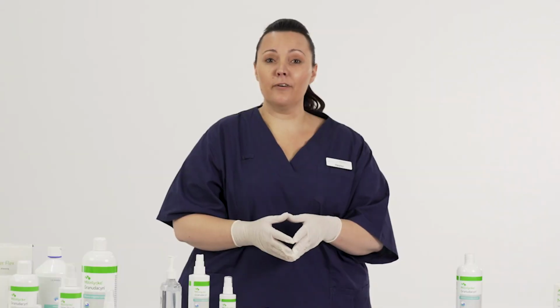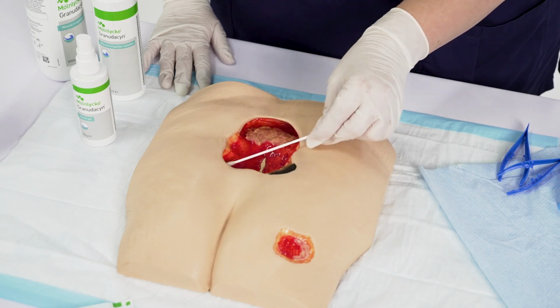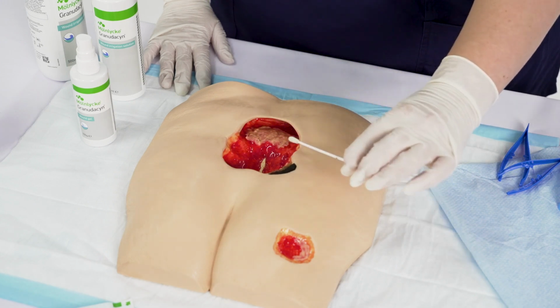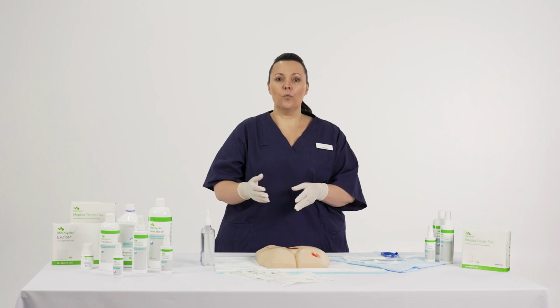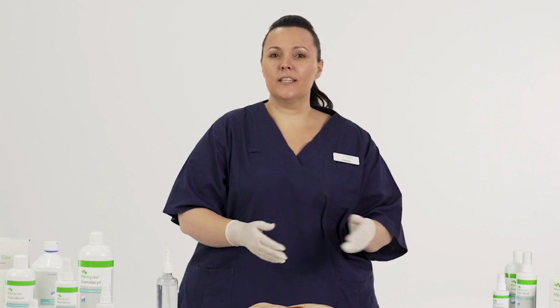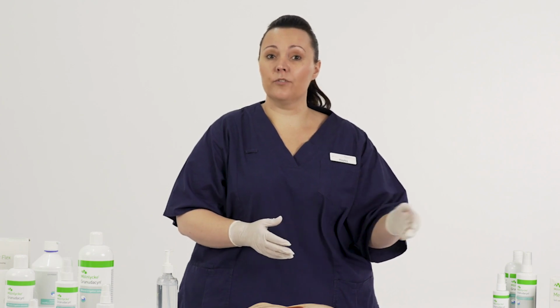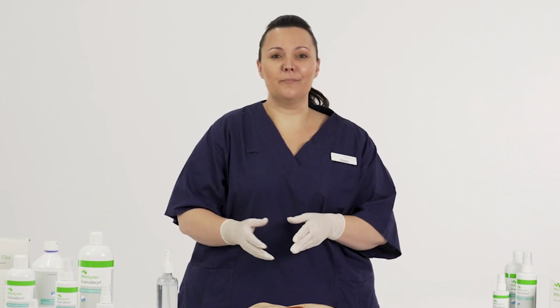Following wound bed preparation and cleaning, the wound bed needs to be reassessed for the tissue type. If the wound bed is deep, such as a cavity or tunnelling, or if there's any moderate to high amount of exudate, the wound bed will need to be packed with a gelling fibre dressing. Today I'm using Extra Fibre, or if the wound is showing signs of infection, you may want to consider an antimicrobial dressing such as Extra Fibre AG+.